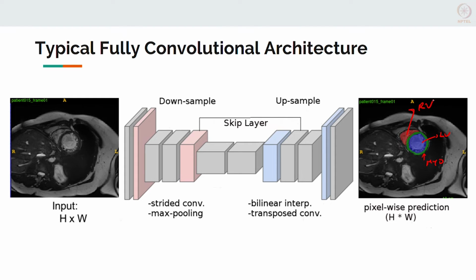So, how do we do that? We saw that by shifting to a fully convolutional neural network structure, we can do semantic segmentation in one stroke. Basically, the entire image through one pass, all the pixels are predicted. That is accomplished by this encoding layer, and this decoding layer. The decoding layer uses bilinear interpolations or transposed up convolutions to increase the size of your feature maps, so that you are able to predict all the labels in one shot.